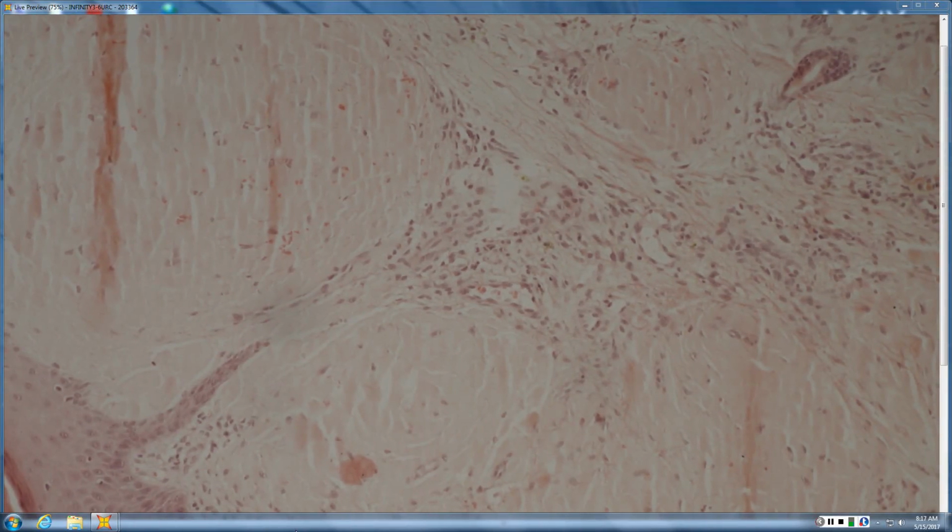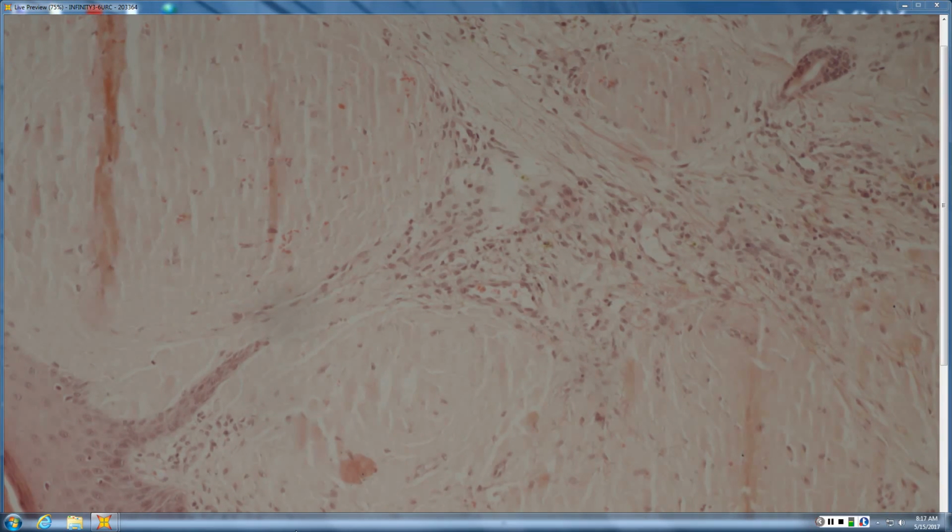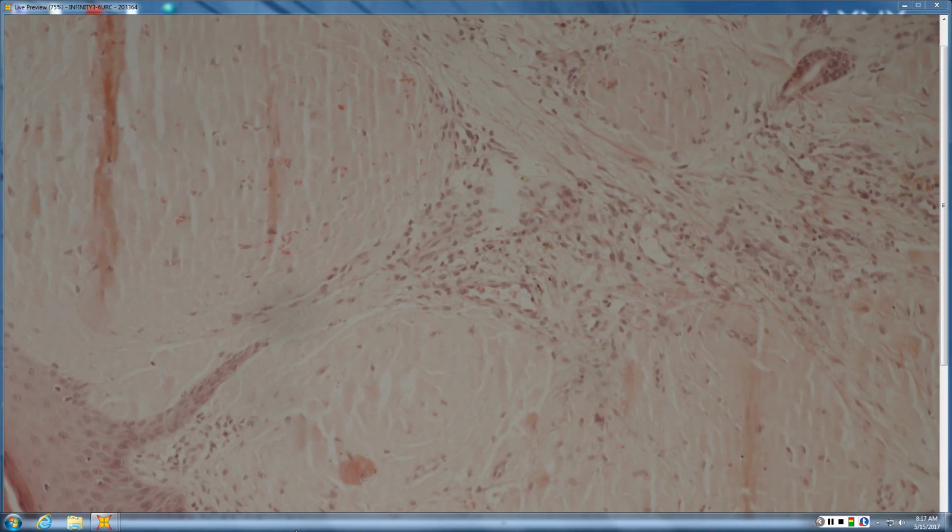Crystal violet is very sensitive for epidermally derived amyloid, but immunoglobulin derived amyloid does better with thioflavin T or Congo red. How does colloid milium look different than that? Colloid milium stains a little. It picks up amyloid stains, but weakly, and then on H&E, colloid milium is much more fissured. Background of solar elastosis, and you can see transition between the elastotic fibers and the colloid milium. That's the best way to do it.